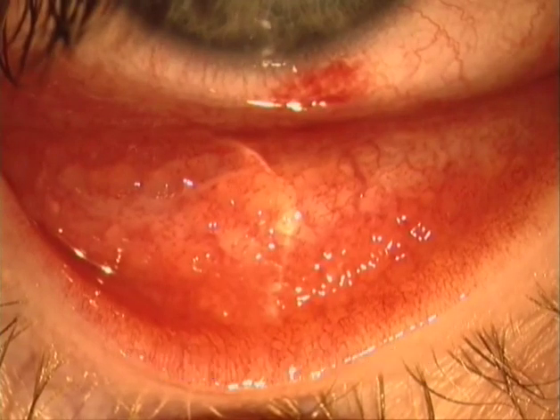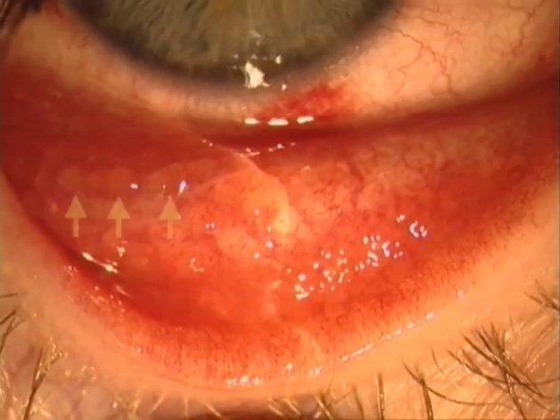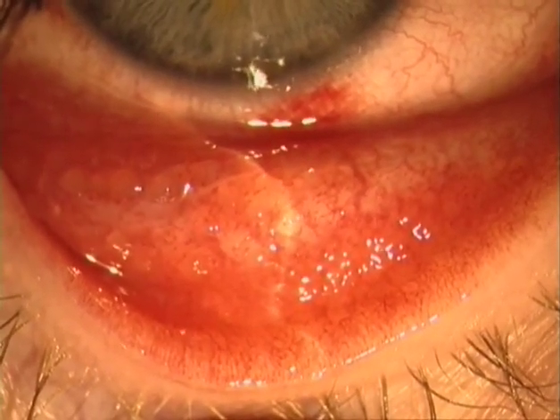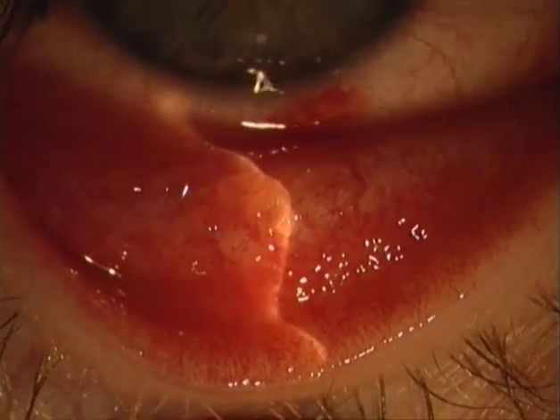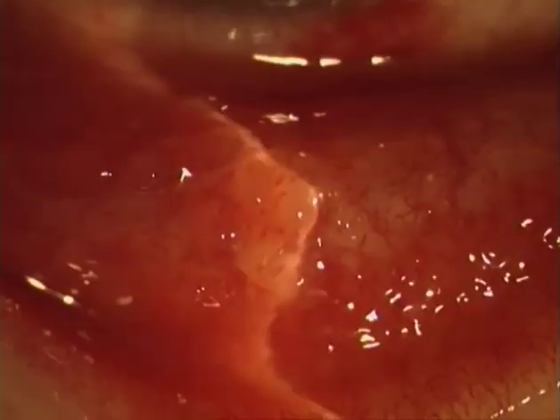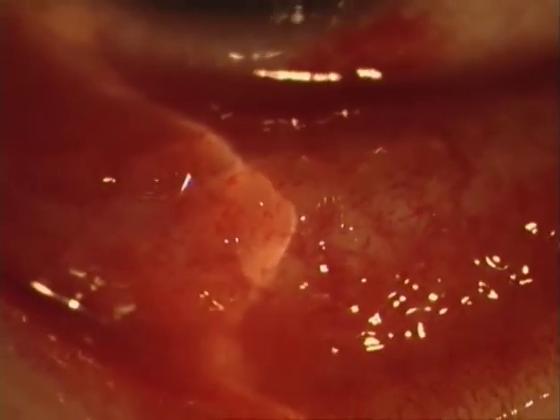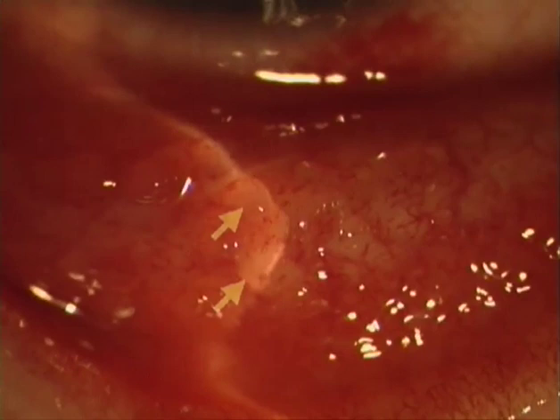Transparent follicles. If they are transparent, follicles can be recognized by their surface reflexes, or with the narrow slit light where their bulging surface can be made out. The homogeneous content of the follicle propagates light and appears in indirect lateral illumination as an extension of the illuminated area into the dark surrounding field. The superficial vascular corona is easily visible in retroillumination against the background of the illuminated core.